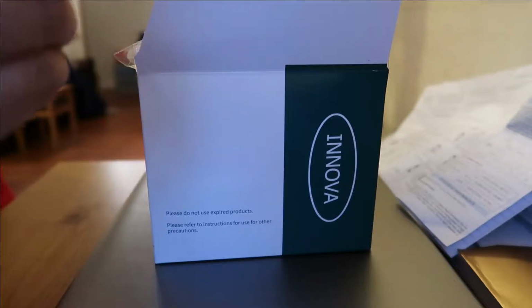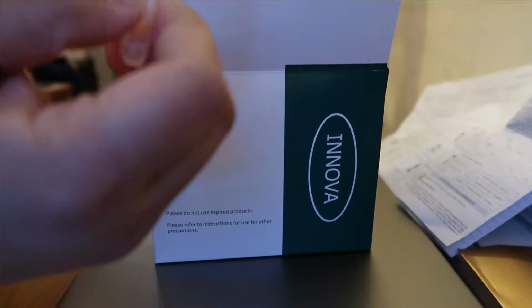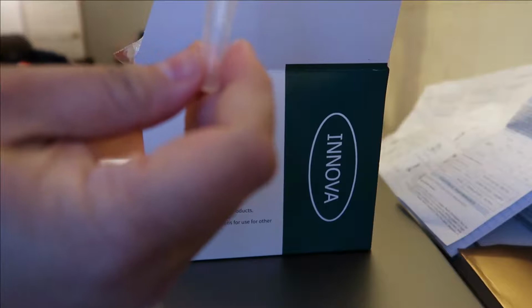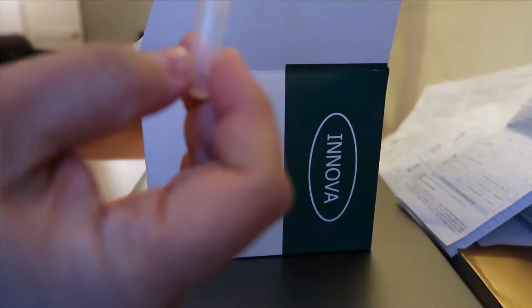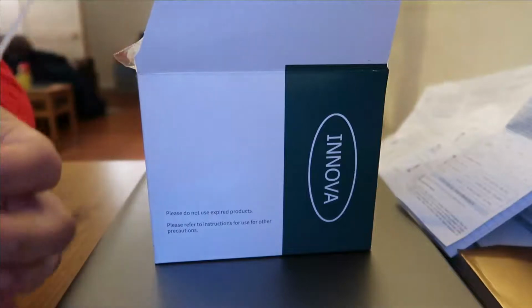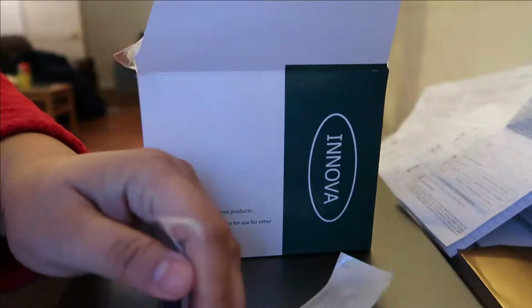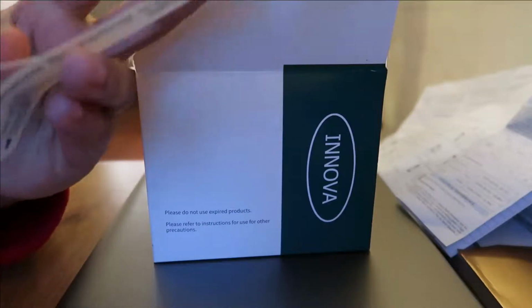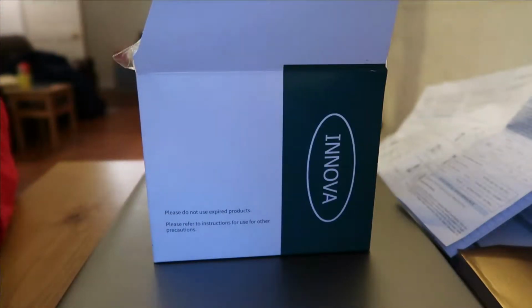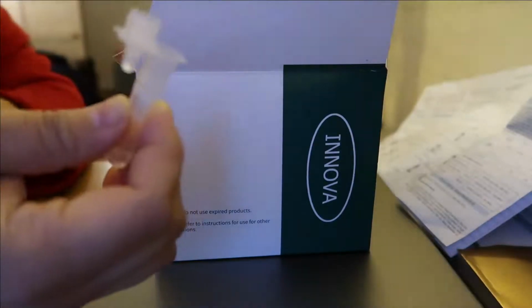Then dispose of the swab. So squeeze it. Because this extraction tube is quite soft, when you squeeze it, you're actually removing the liquid from the swab, so that all the antigens are now in the extraction solution. And how you dispose of this, while I'm still holding the extraction tube, I put the swab back into the wrapper that I opened it from, and basically insert it back. That's what I do. Okay, so it's back here. Even if I put it on the table, I'm sure it won't contaminate my table because it's inside already. Okay, I'm still holding this.